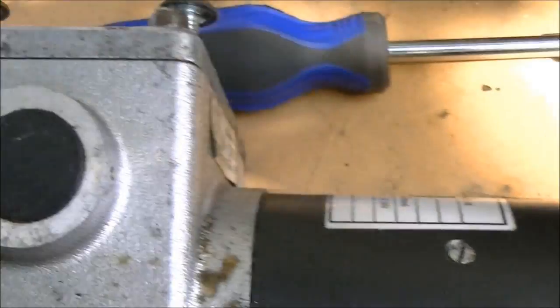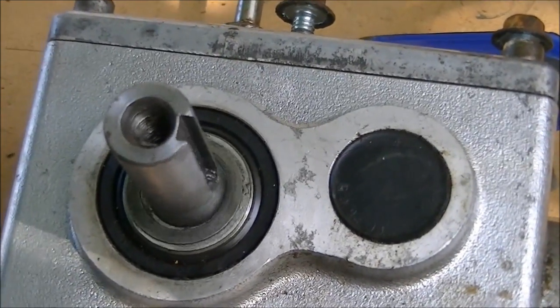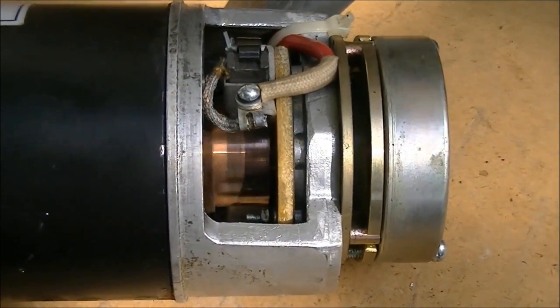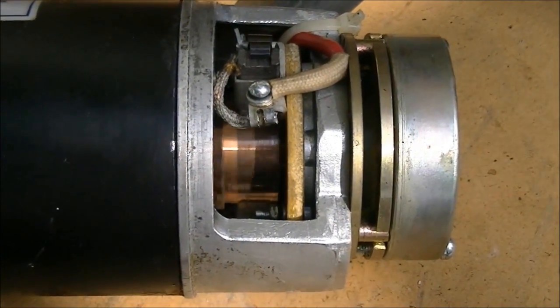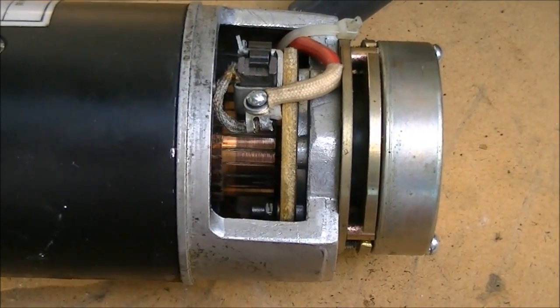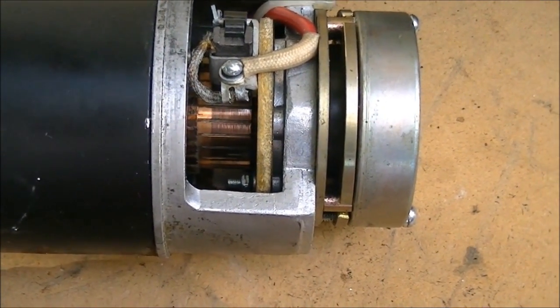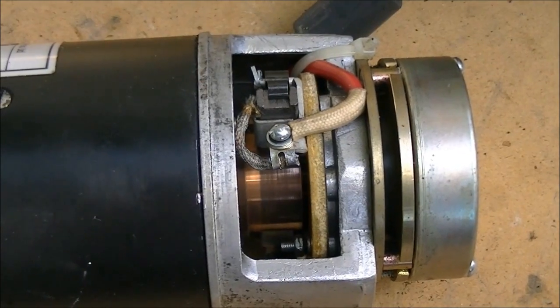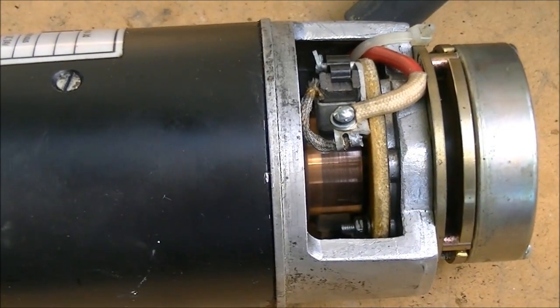I'm only running it on 12 volts right now and I have the gearbox engaged — now it's starting to squeak. Maybe I'll hook it up to 24 volts and see what happens. Now I have it hooked up to 24 volts, turning it on. That seems to be working a whole lot better than what I had previously.